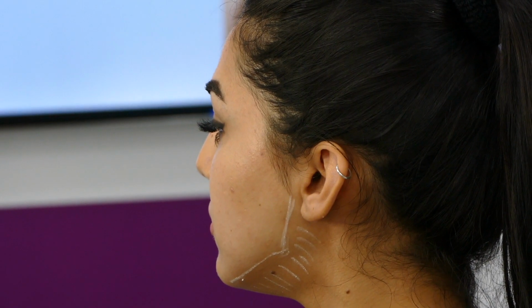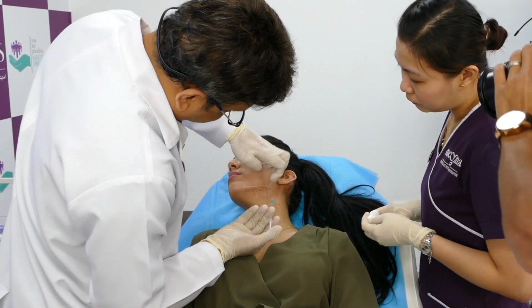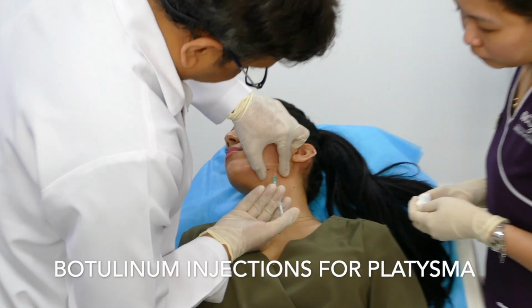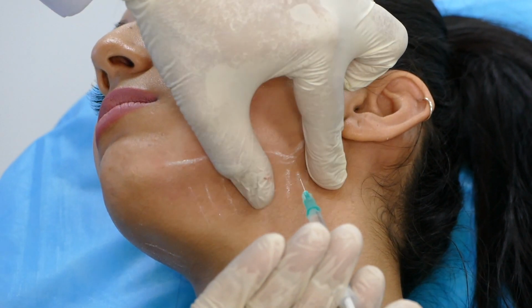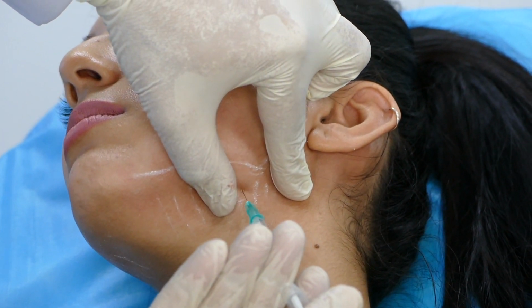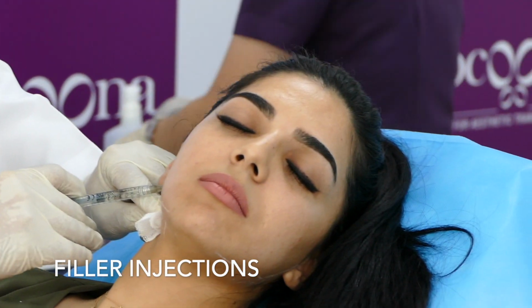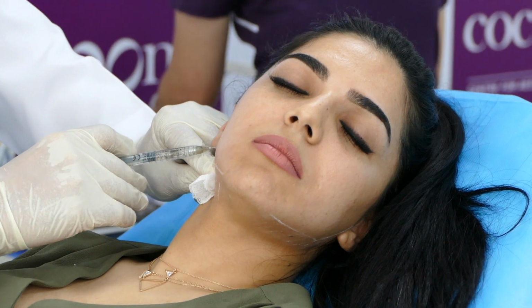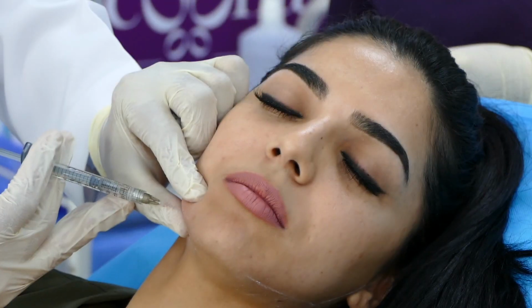So I will start the procedure with botulinum injection. It's approximately 20 units injected parallel to the lower border of the mandible into the platysma muscle all along the mandibular border. This will allow the muscle to drape the neck better and give more depth to the neck.